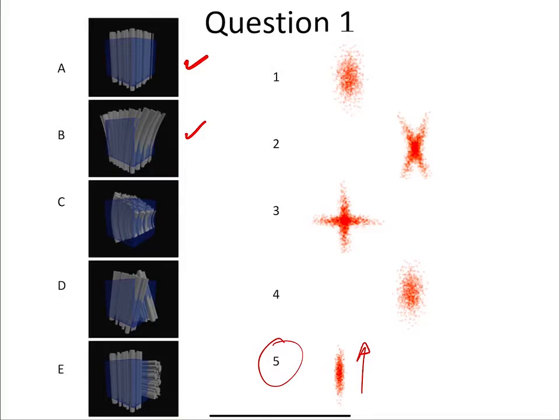Right. It could be 1 or 3, but 1 is pretty good. Okay. 1 and 3 or 1 and 4? Well, 1 and 4, right? They almost look the same. Is there any meaning in the fact that they're shifted? One is called fanning fibers, and the other is bending fibers. But you can see they're going to give you the same problem, right? You've got 2 directions emerging like this, or 2 directions this way.